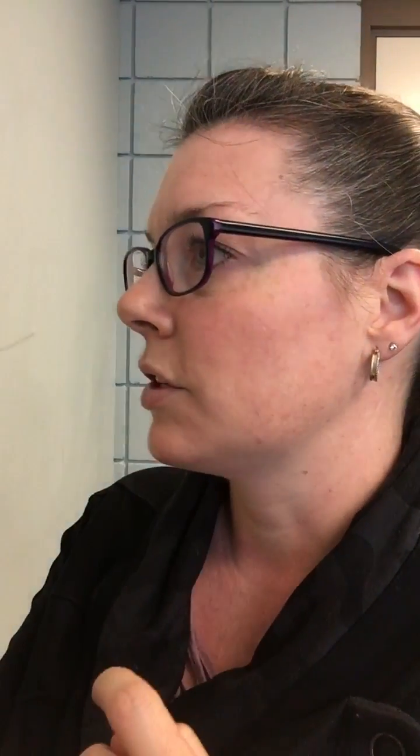Today I have a flocked swab — these are a bendable swab. When you first pull them out they're sometimes a little bent, and if that happens you're going to want to go this way. If that bend is pointing upwards, that's when you tend to be pulled up into the highly vascular, bloody areas where it causes lots of discomfort, pain, and nosebleeds.